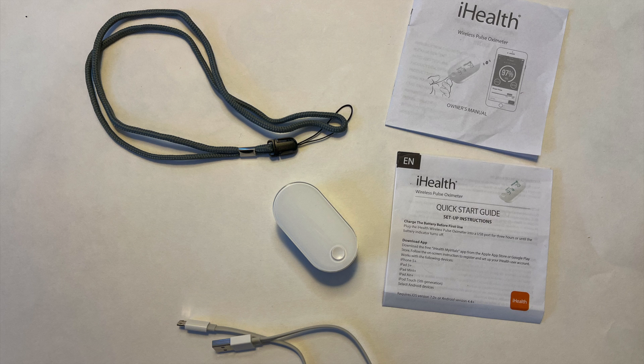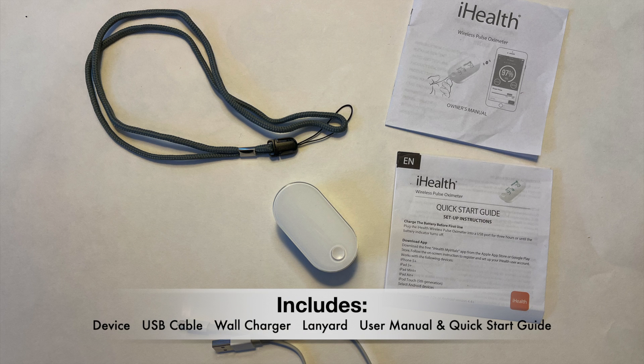Inside the box you'll find the pulse oximeter device, a USB cable, a wall charger, an optional lanyard, as well as a user manual and a quick start guide.